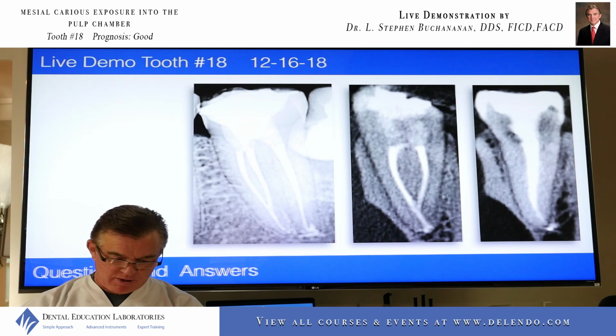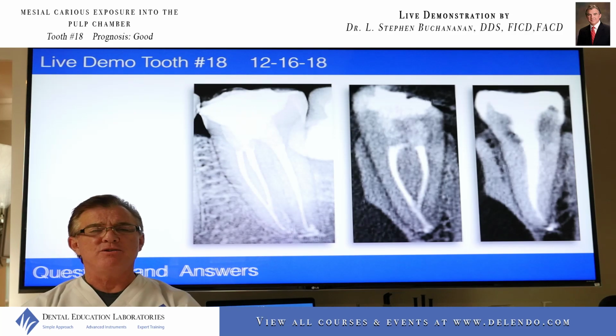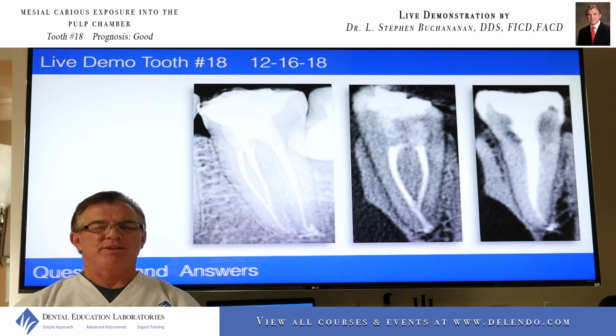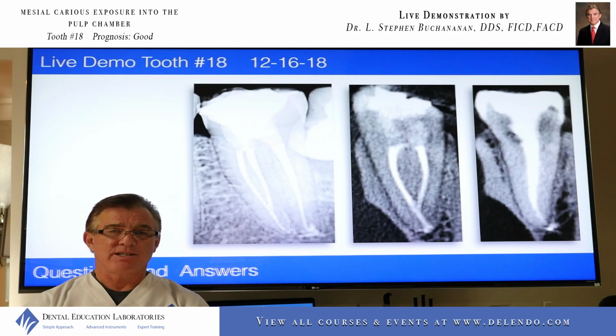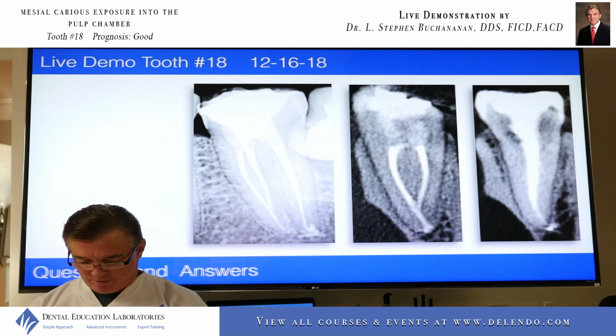When I have my eyes in the oculars, even with extended oculars, I'm severely limited. I can usually not put the camera body down over the patient's torso and aim up at their maxillary teeth. Right now I do accesses without a mirror on maxillary teeth all the time. It's really simple. So that's one of the coolest new technologies I've ever used. As I said earlier, I think it's going to extend my career by a number of years.